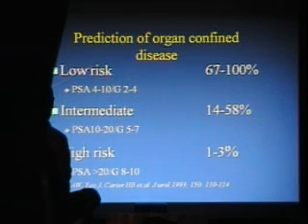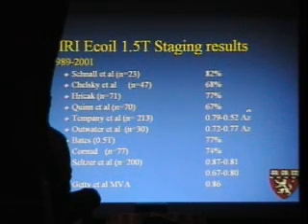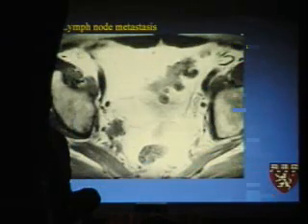There are some men that really need MRI. They fall into this intermediate group where PSA and Gleason will not stage them accurately. They're the ones with these indeterminate numbers, where the numbers will not predict whether it's advanced or not. MR can be useful. There's a definite learning curve to doing this. Lots of studies showing that over the years. We've got some good features now, and I think we understand it well.